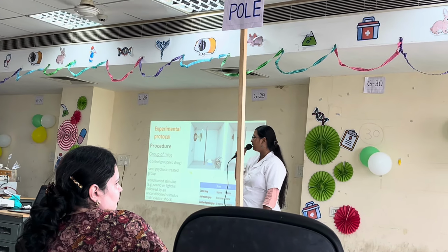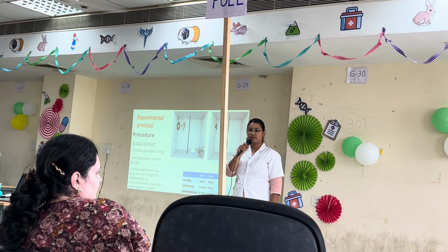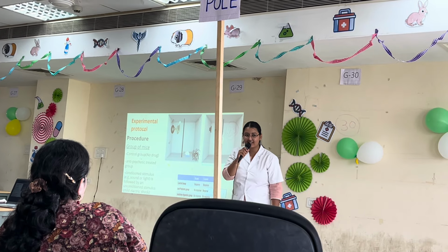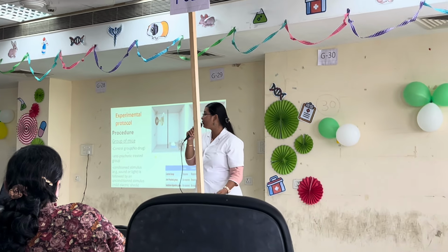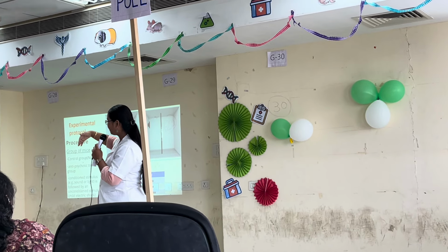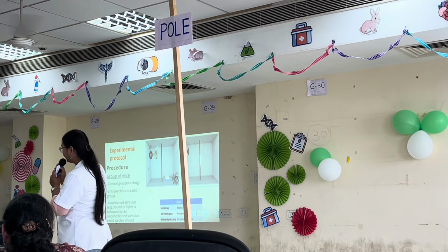And the experiment begins. As you can see, there was no response because sedatives and hypnotics manipulate our physiological actions, which will be demonstrated live by my batchmates. So here we have two functions, which are the higher function of the brain and the limbic system.